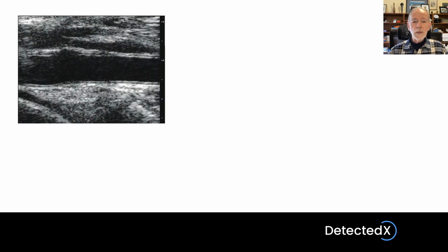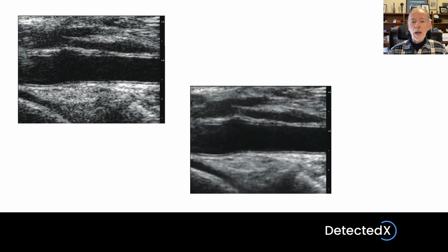Here's another example. This is a popliteal artery. The standard image on the left shows quite a coarse speckle pattern and quite a significant amount of artifact echoes within the vessel. This is probably a combination of reverberation and perhaps some slice thickness artifact as well. In the compound image, in the center of the slide, you can see the speckle pattern is very much smoother. The tissue structures within the surrounding tissues are clearer, and the artifact in the vessel is still visible. It simply has a slightly different appearance.